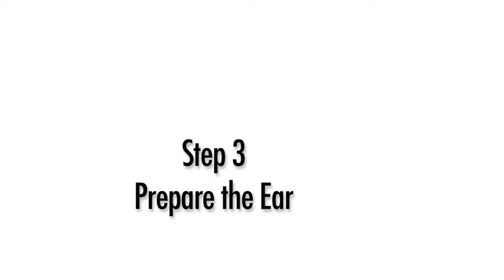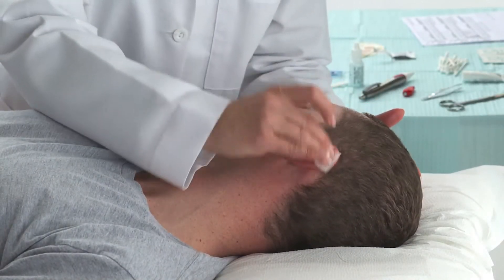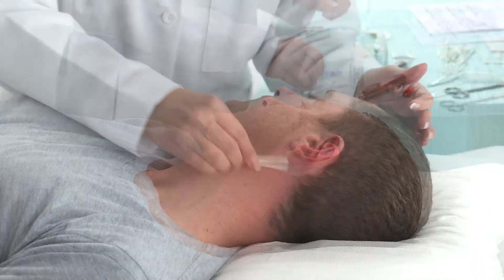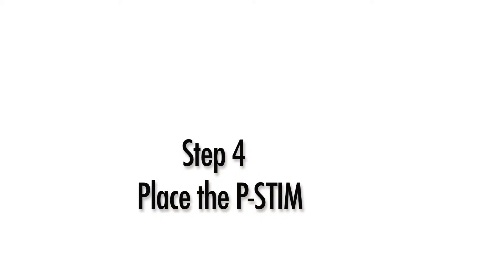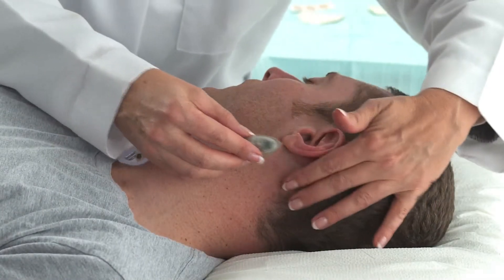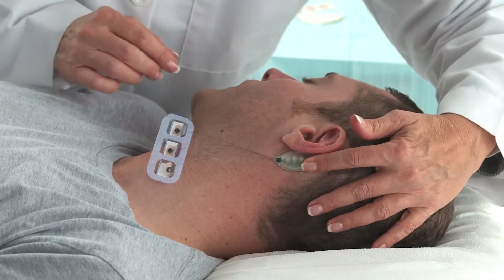Step 3: Prepare the ear. Thoroughly clean the ear using an alcohol pad. Clean well behind the ear to remove oils and dirt to assure proper adhesion of the P-STIM control module. Apply Prep and Stay to the area just cleaned. Step 4: Place P-STIM. Apply TAC gel to the back of the P-STIM control module. Place the P-STIM control module behind the ear with the wires pointing down. Press and hold the module for 30 seconds to assure proper adhesion to the skin.